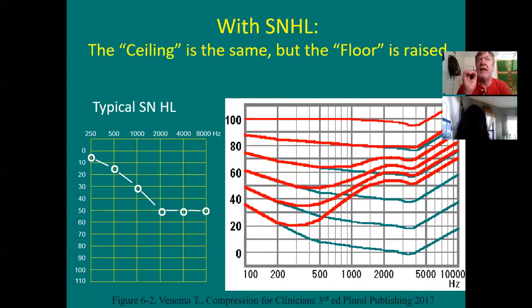And you know that MAP is, capital letters, bold-faced, italics, 0 dB HL. So this top 0 dB on the left on your audiogram has these different decibels built into it. And that's why your audiometers are calibrated every year. So that 1,000 hertz at 0 dB, look where my cursor is, that 0 there really is this many right here.